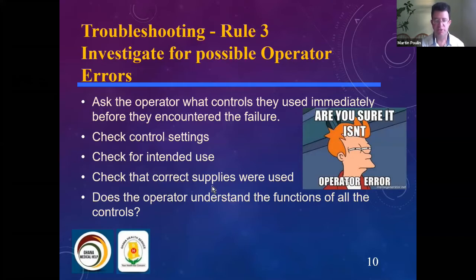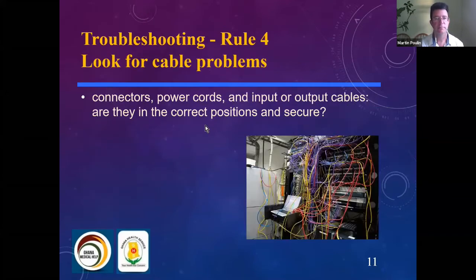Assuming there are no signs of mechanical damage to the device, do a self-test or calibration of the device. This may also give you the error log on the device, which you can review and help with the diagnosis. Unfortunately, all too many techs will stop the process if the self-test passes, but there can be other problems that are not part of the self-test process. So you want to make sure you do a complete, full troubleshooting before returning the device to use.